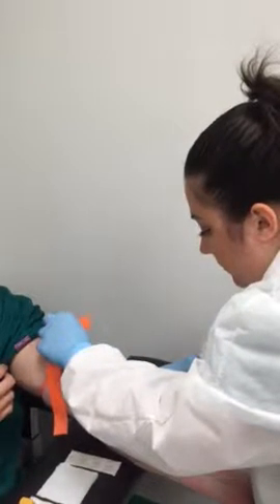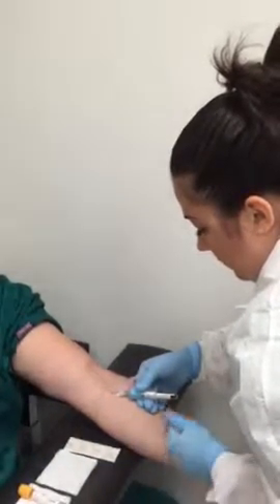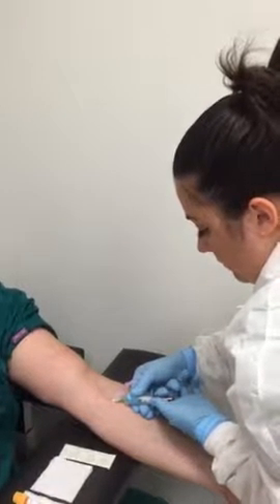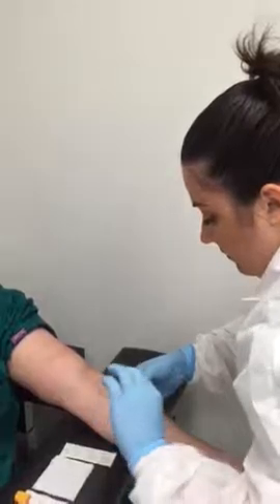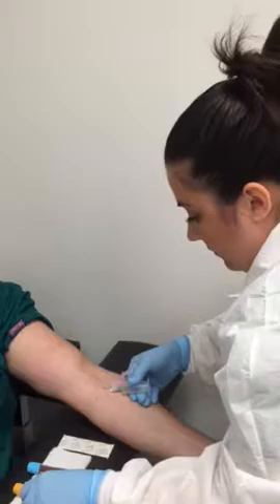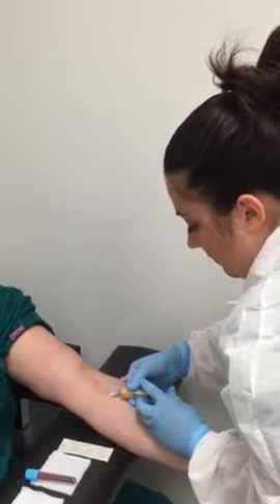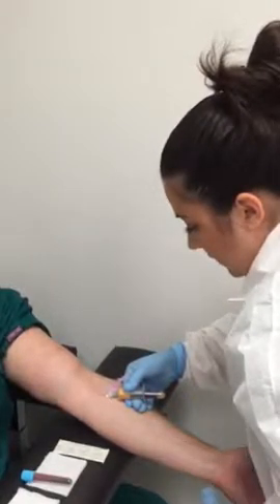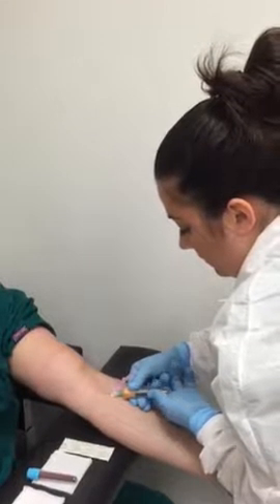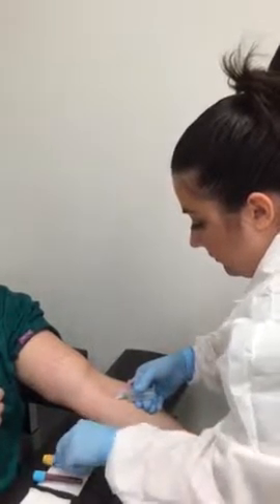She's going to insert the tubes using the flanges. Once blood flow is established, she removes the tourniquet. She's going to pull the tube out using the flanges and then mix it immediately, before she places it down — making sure it's filled. She's going to use the next tube in the order of draw, inserting it using the flanges again. Once that tube is full, she's going to pull it out, mixing that one also, before she puts it down.